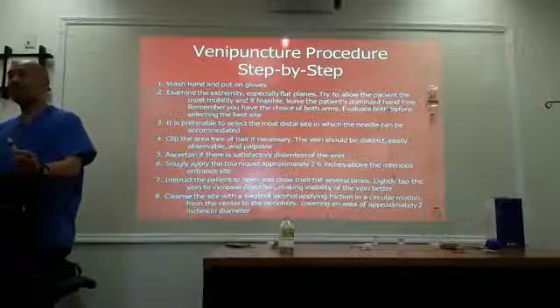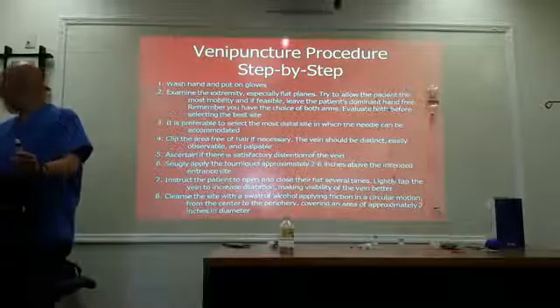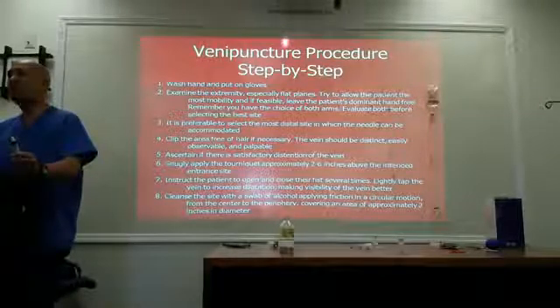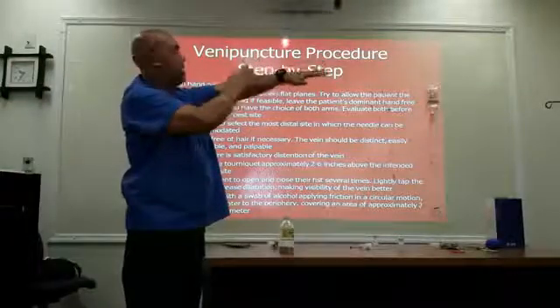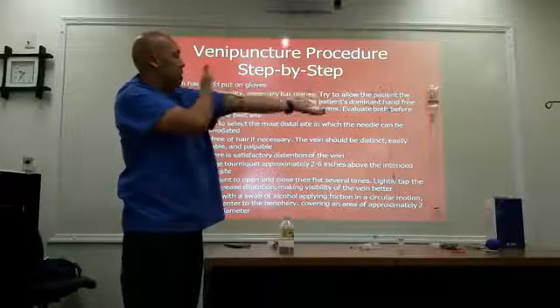Ascertain if there is satisfactory distension of the vein. Snugly apply the tourniquet approximately 2 to 6 inches above the intended entrance site. Again, if you're doing hand or wrist, okay? If you're doing forearm, tourniquet around here. If you're doing elbow, tourniquet up here.